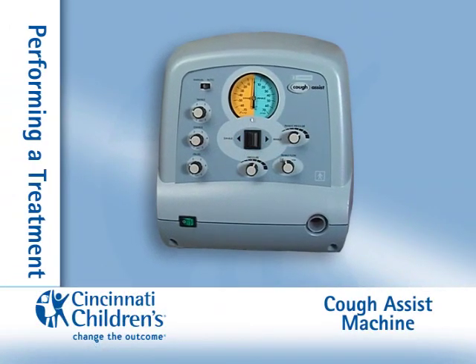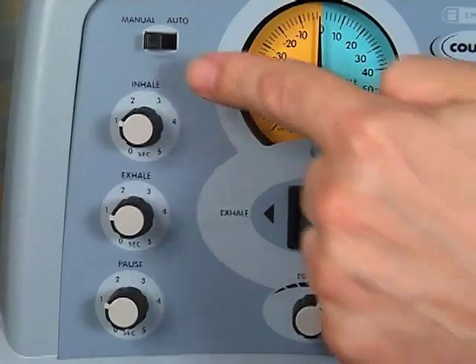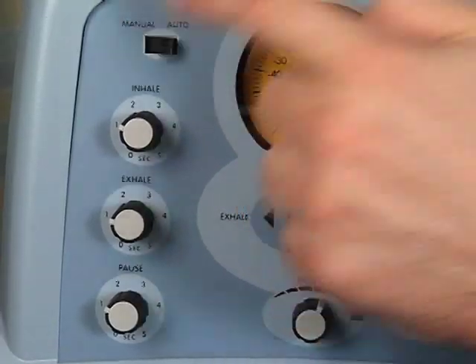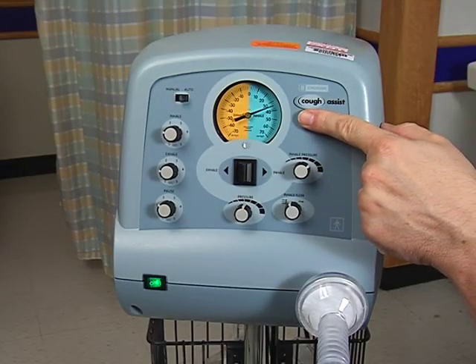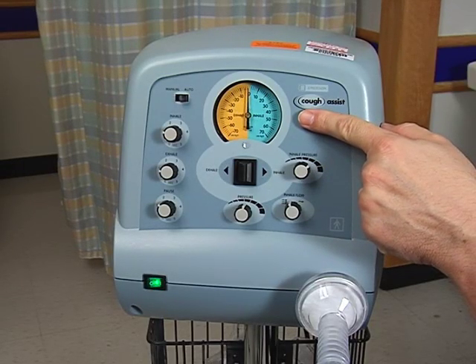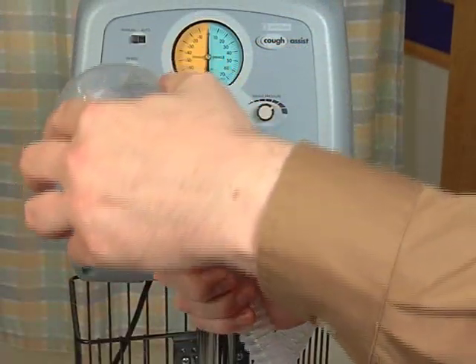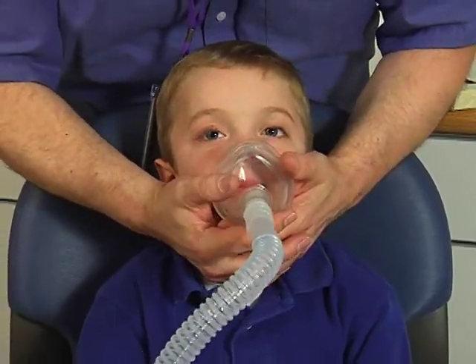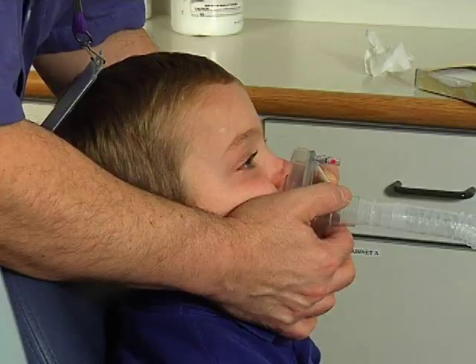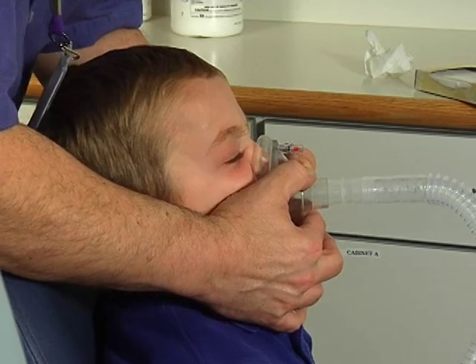Performing a treatment. Turn the machine on. Set the manual/auto switch to auto. The unit will then automatically cycle from the positive to negative pressure and back to zero for the pause. Reattach the mask or mouthpiece to the tubing. When using a mask, place the bottom of the mask underneath the chin and the top of the mask on the bridge of the nose, and place it tightly on your face or mouth so that no air leaks out.